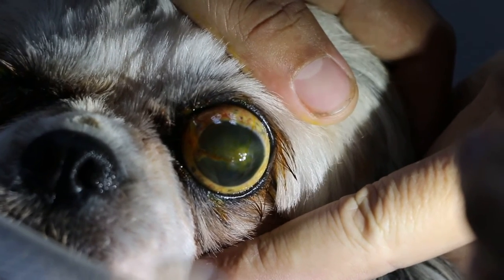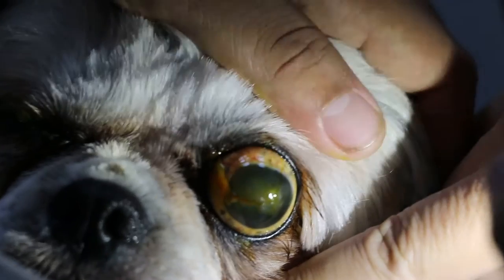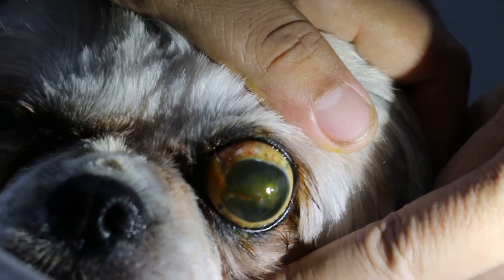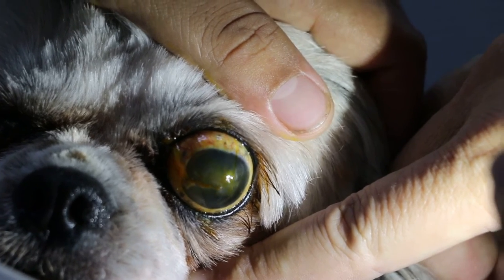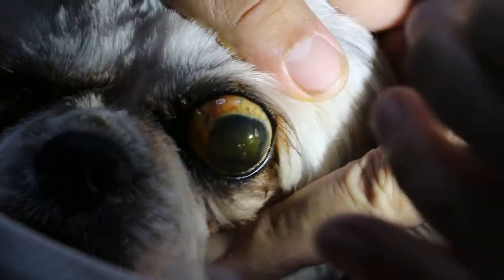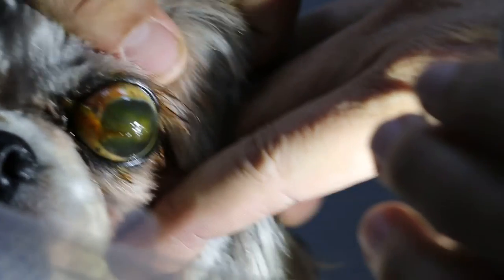It's about 70%. Now the scar — maybe 50%. But the central one is a problem. It's a central one. Early on, but this one is not so deep, not so serious.